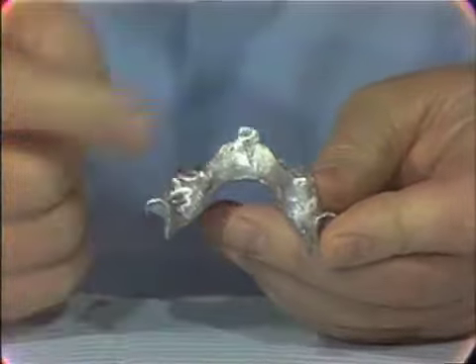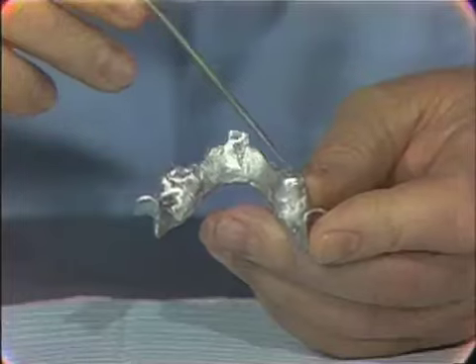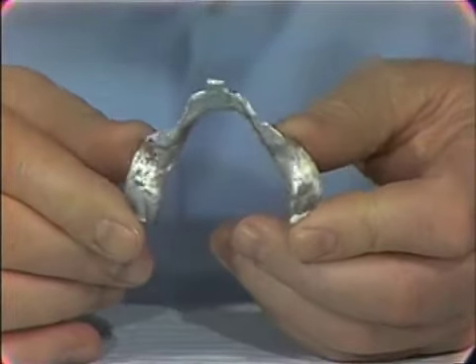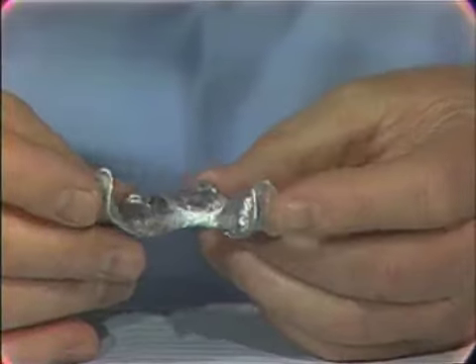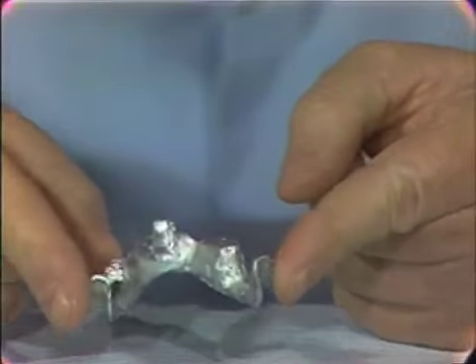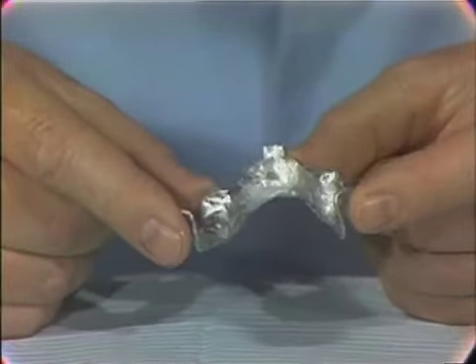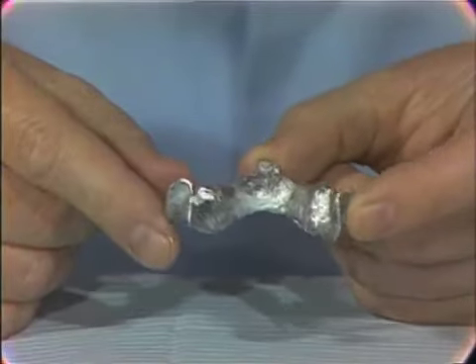The problem exists in the lower free end saddle impression, where you have a lingual bar area. This should be rigid enough and thick enough to give rigidity, but yet not bulky enough to prevent the normal positioning of the tongue. The impression tray should be lightweight. It should actually float on the material so that it wouldn't sink to the bottom of the material and touch the tissue. The tray should not touch the tissue at all. The tray should not be bulky so that the tissues can be in their rest position.